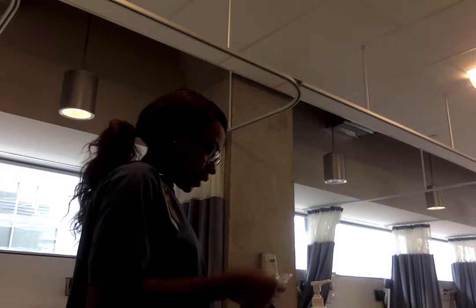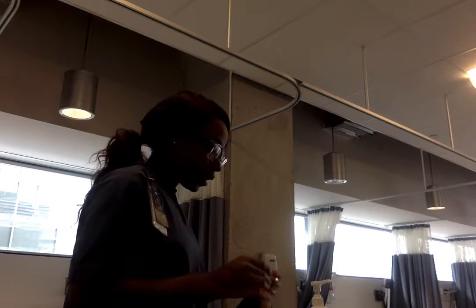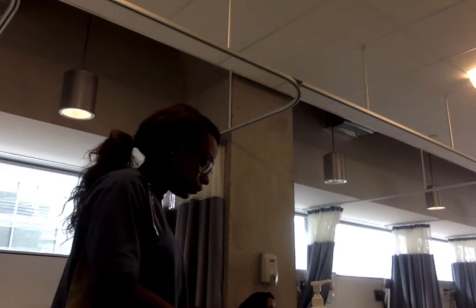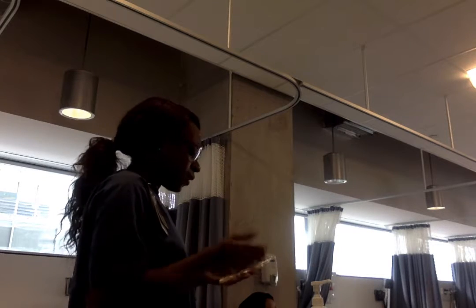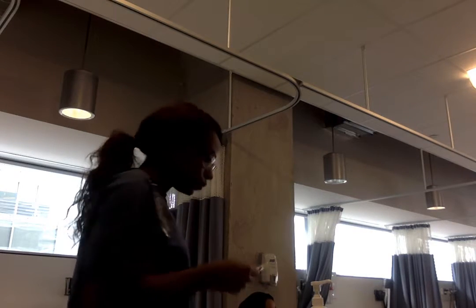Gently agitate the medication. And place my medication label on the back of the medication. So I confirm that I have the correct medication in the correct piggyback and for the correct client again against the MAR.